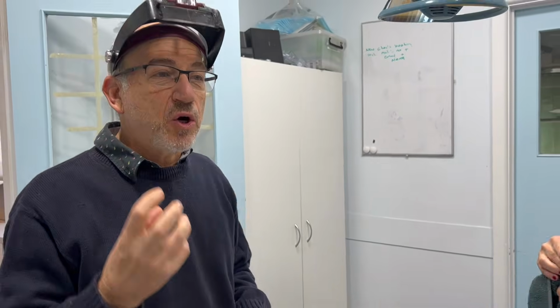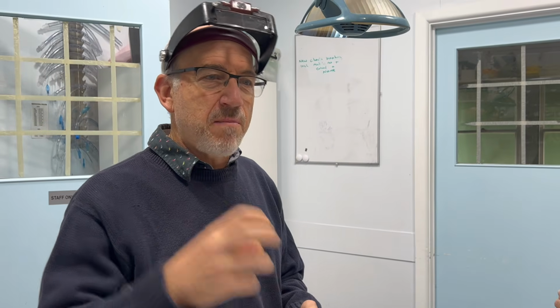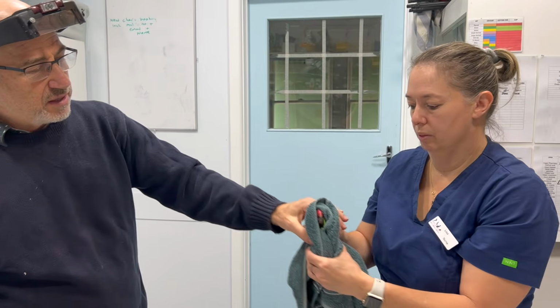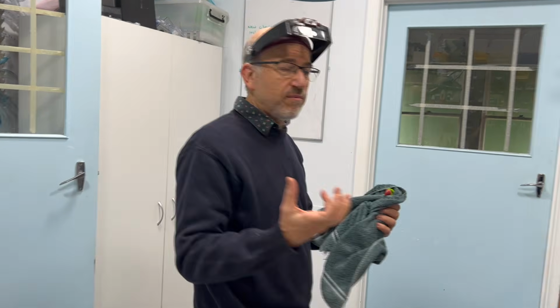So I'm hoping, because I know I've got infection, I know I've got bacteria, I know I've got problems, by injecting it into the gland, we're going to get massive amounts of antibiotics exactly where we need it. Remember, when you've got a cavity and you're giving antibiotics orally, it's more difficult for the medication to penetrate. So this would really help it, and you can see there's no major trauma or pain when I did it because I'm filling a hole up.